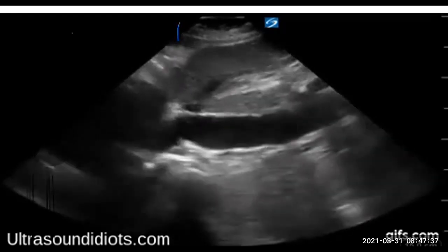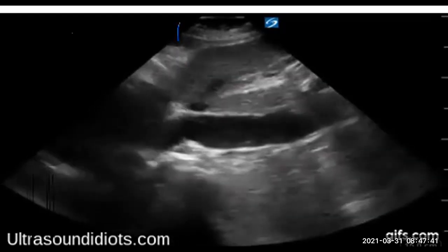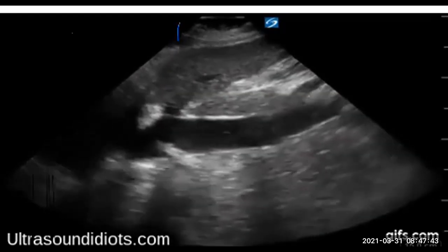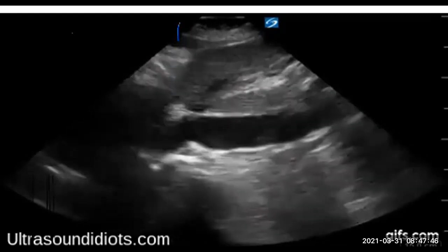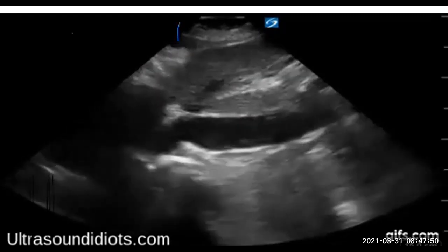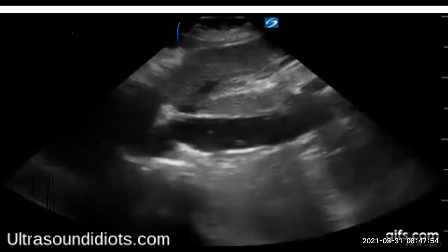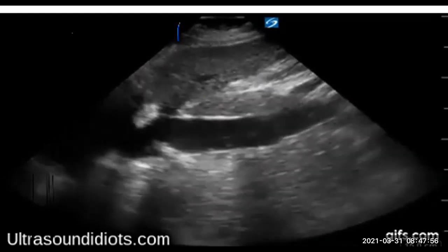Okay. After this, the only other thing that you would do is look for sources of emboli. All right. Now, there's cardiac sources, which we haven't looked at yet. We'll look at them later, but DVTs we've done. So you guys know how to look for a DVT. That's where you would go next. Say, does this patient have signs of a DVT? If this patient has signs of a DVT, that's where my embolus came from. You get what I'm saying? All right. Any questions? Yeah.